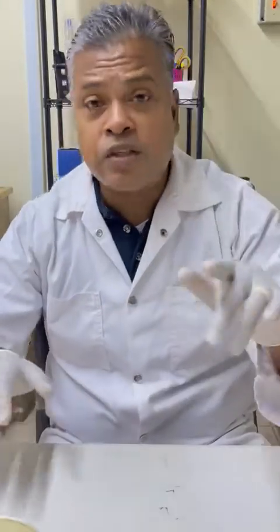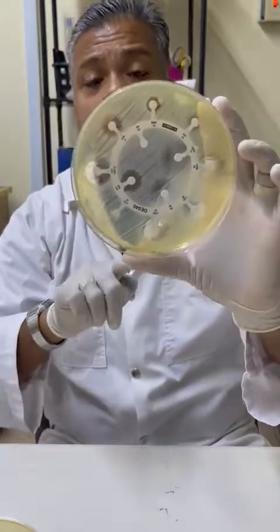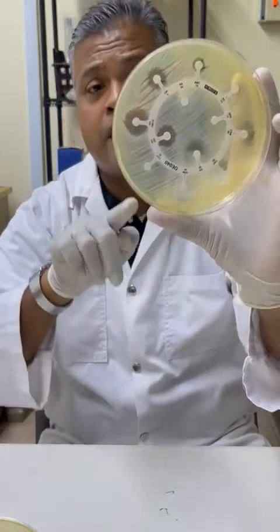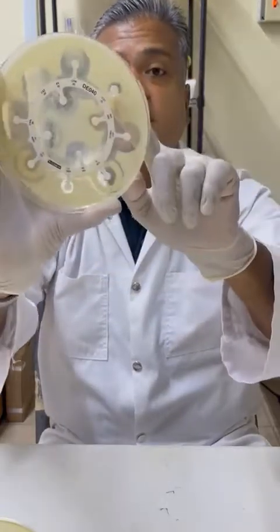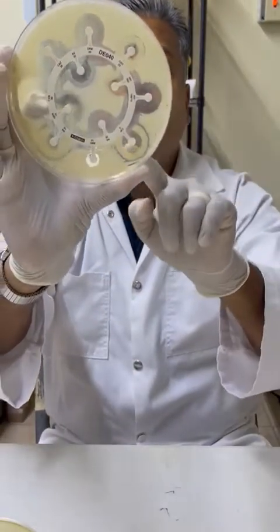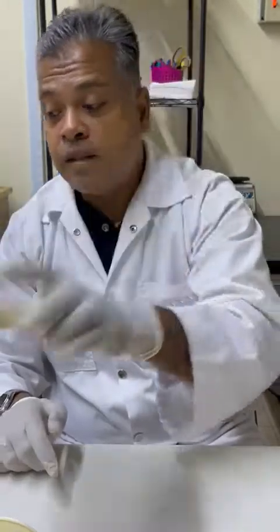That is a 4th patient with a significant urinary tract infection. Here we've got resistant to Augmentin, resistant to ciprofloxacin again, and resistant to Septra. In our 6th patient here this morning, resistant to Septra, sensitive to ciprofloxacin, and resistant to Augmentin.